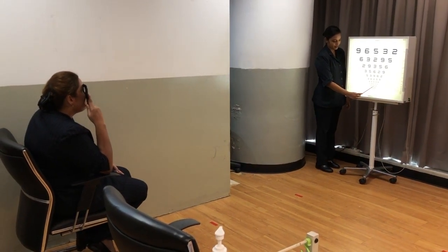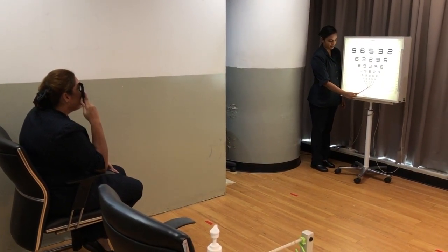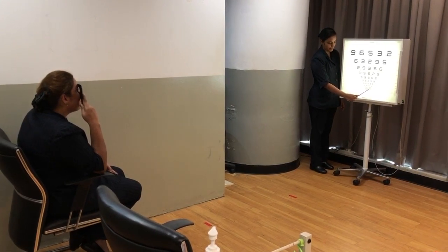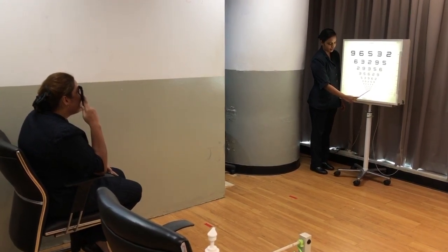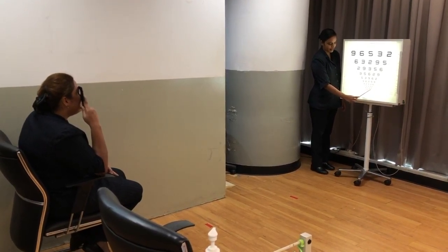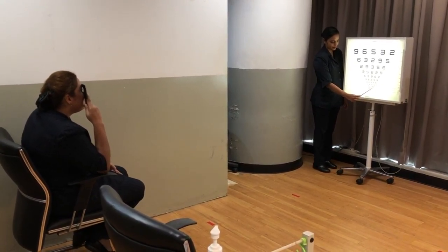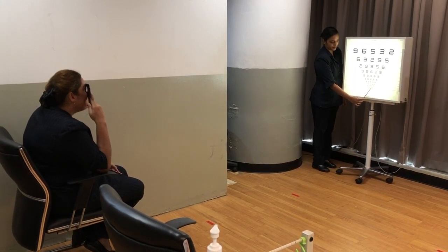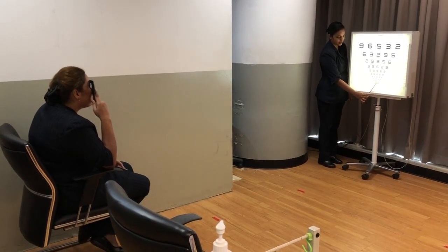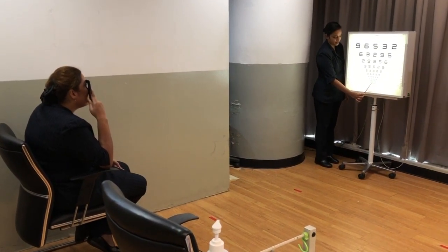The person who checks vision usually listens to what the test subject says. Imagine this in a mass screening area or a busy clinic — it is difficult to listen to what the subject says.